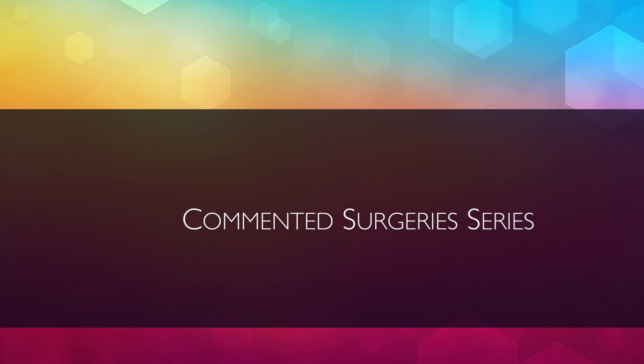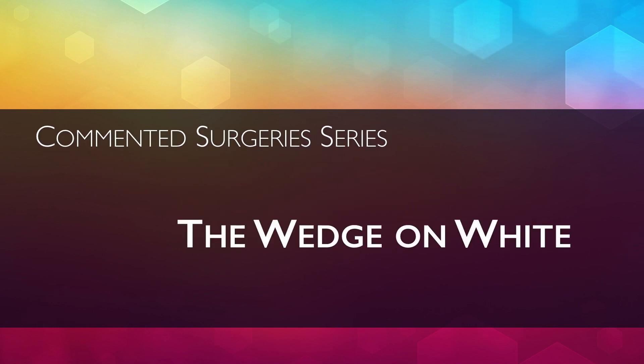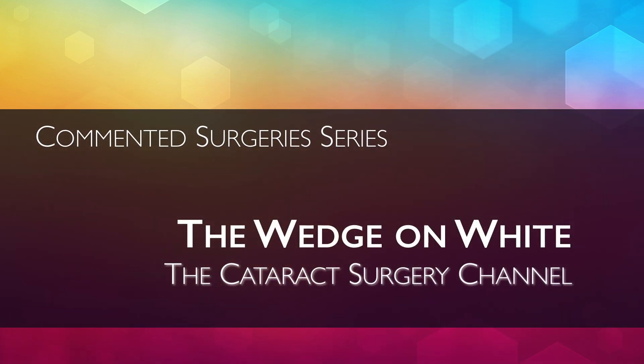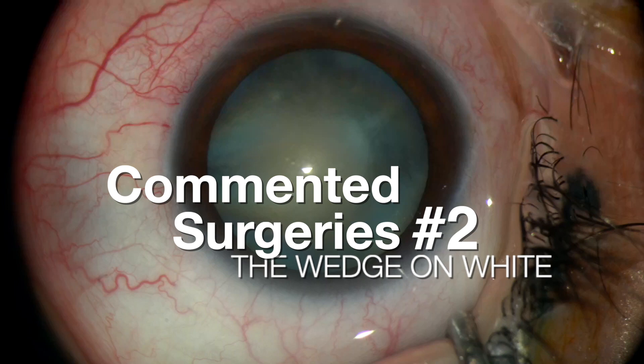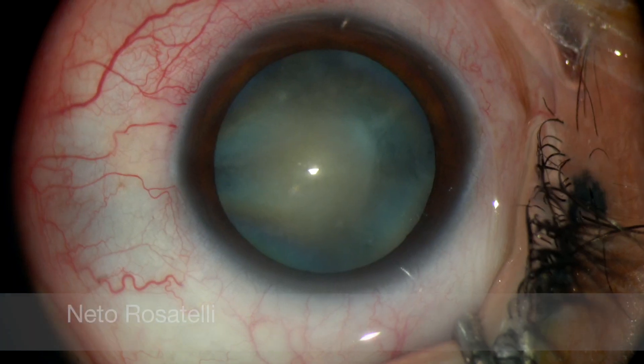Hello, my name is Neto Rosatelli and welcome to the Cataract Surgery channel. In this video I demonstrate the efficiency and safety of the wedge mechanical fracturing on a white cataract.